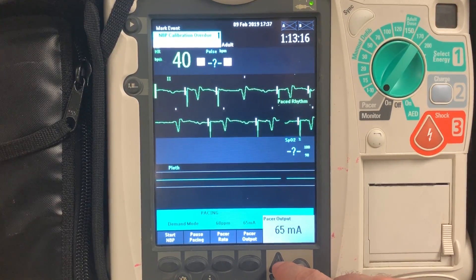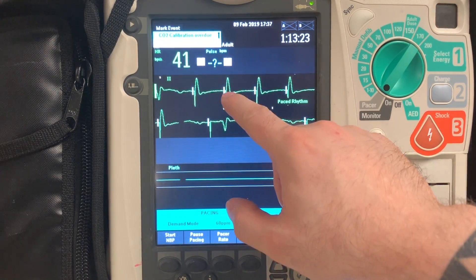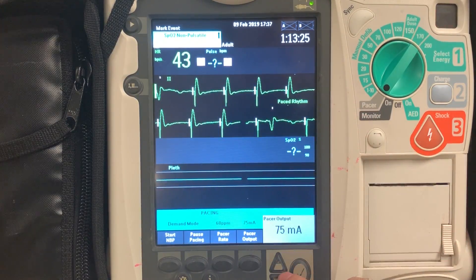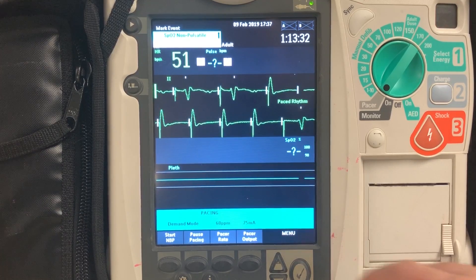So no capture. Now at 75, I see that I do have capture — I have that QRS followed by a broad, tall T-wave. I'm going to go down 5. I lose my capture. I'm going to go back to 75. This way I know I have electrical capture.